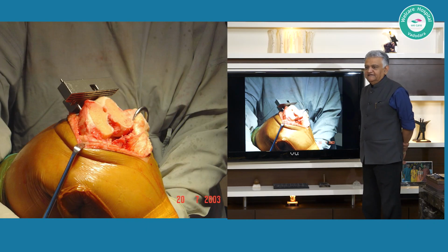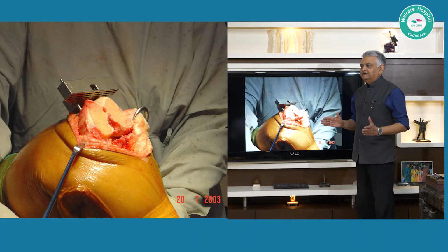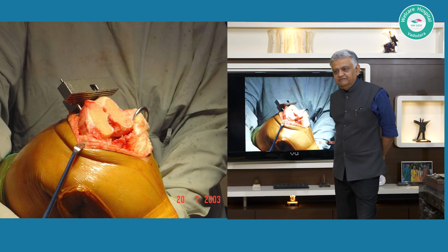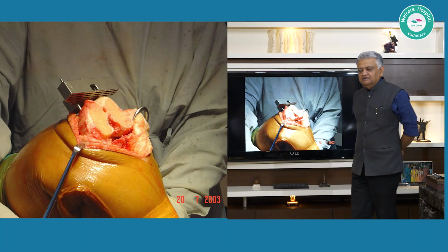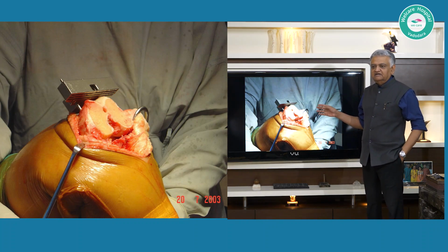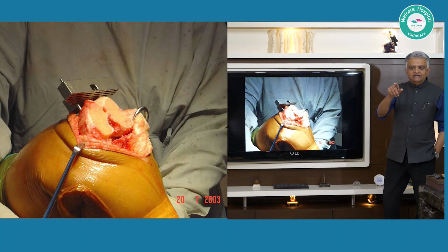Many times when your set has been used again and again, the standard slot would have expanded as compared to the alternative slots. At the end of the day, it will be half a millimeter, at the most half to 1 millimeter. So it's not going to be dramatic in that sense. Anything more than that, that instrument, that piece of block, would have to be discarded. This is half to 1 millimeter.